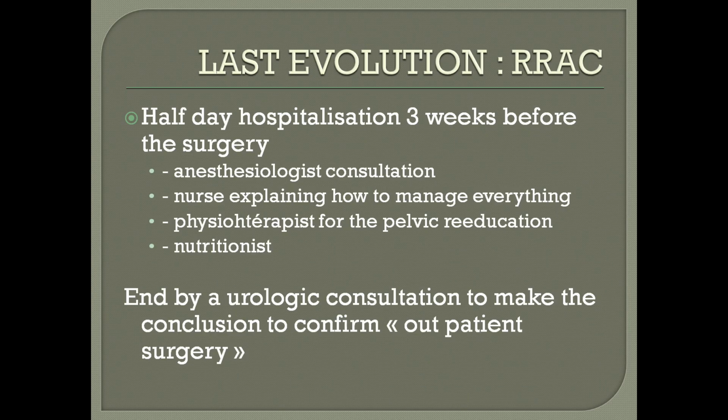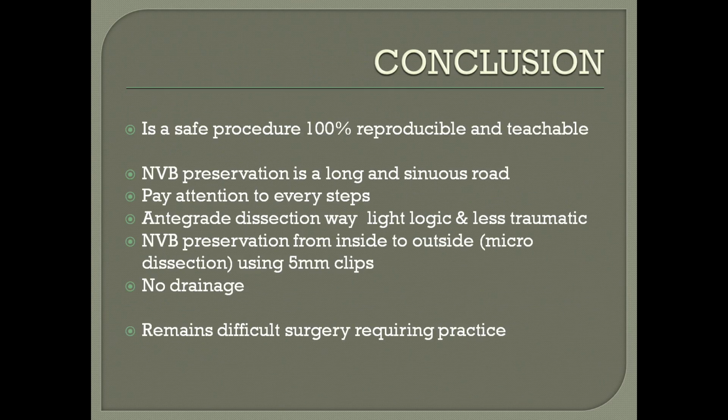That's a median thing. So, to conclude, for me it's safe and reproducible, but I have done a lot. Okay, you have seen more than 3,000, that's why. I'm still convinced that the laparoscopy is fantastic for the prostatectomy.